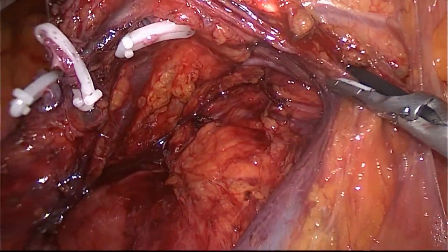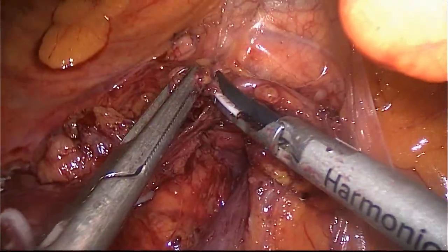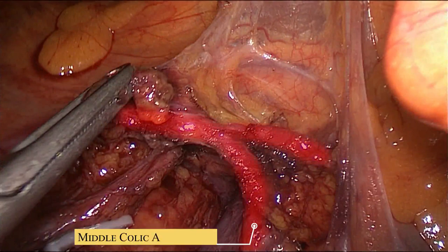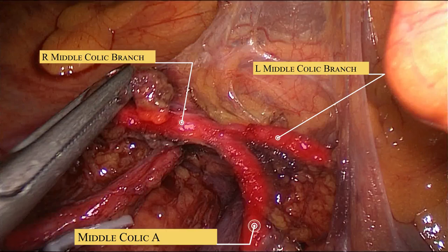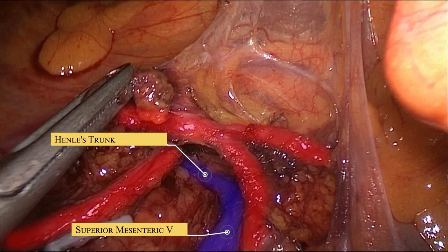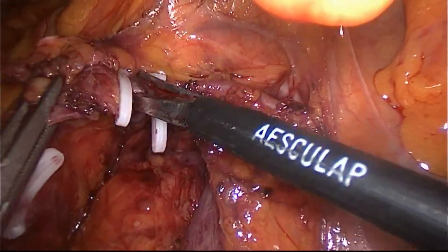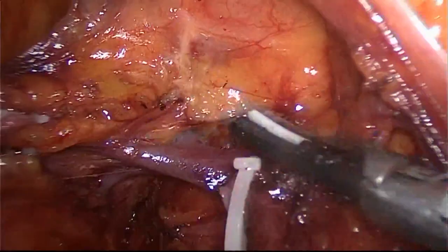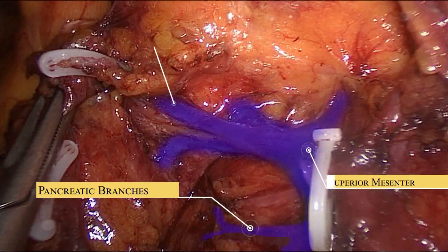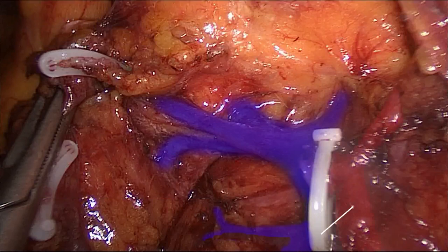Before managing the Henle's trunk, we continue our dissection to identify the middle colic artery. The middle colic artery is dissected at its origin from the superior mesenteric artery and traced cranially to identify its right and left branches. The right branch is prepared and sectioned between two hemoclips. The right superior colic vein is then sectioned at its confluence into the Henle's trunk, while the other branches are carefully preserved.